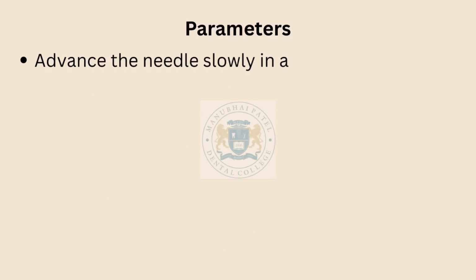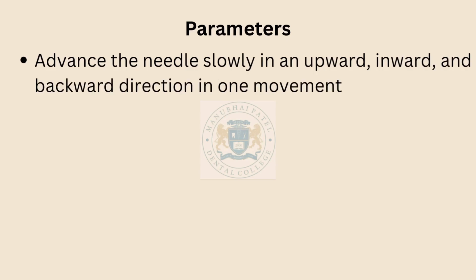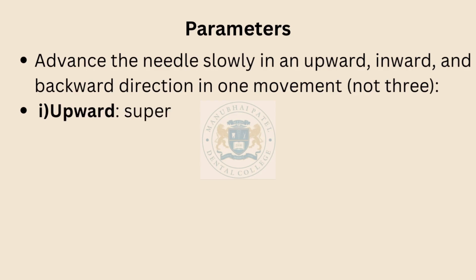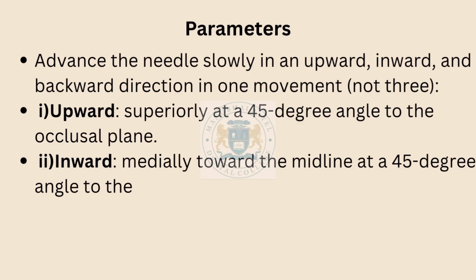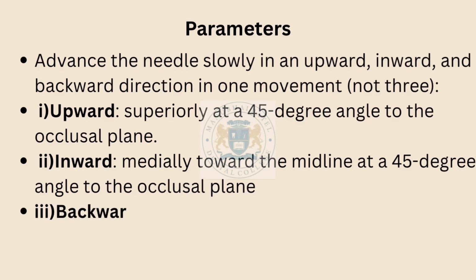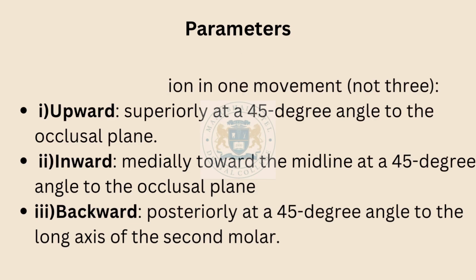Parameters include: advance the needle slowly in an upward, inward, and backward direction in one movement, not 3. 1 is upward, superiorly at a 45-degree angle to the occlusal plane. 2 is inward, medially toward the midline at a 45-degree angle to the occlusal plane. 3 is backward, posteriorly at a 45-degree angle to the long axis of the second molar.